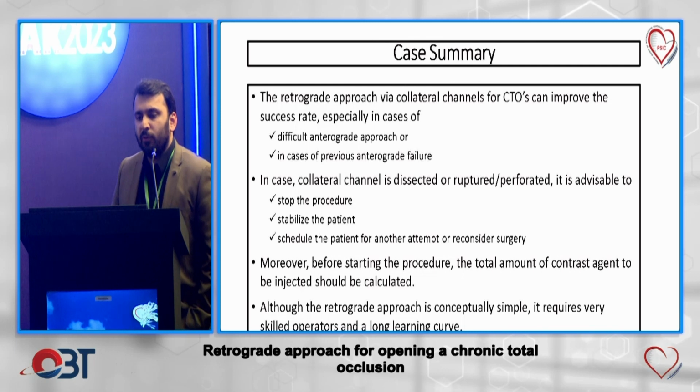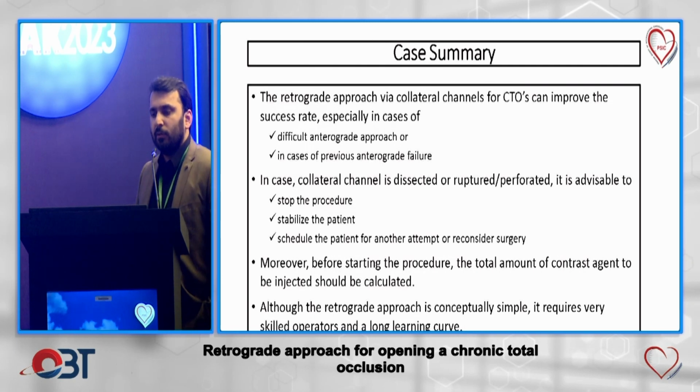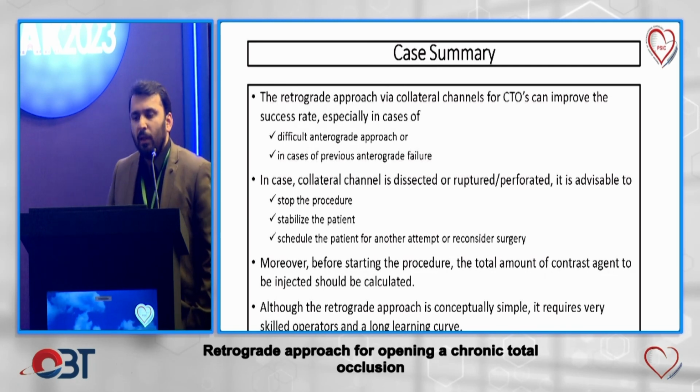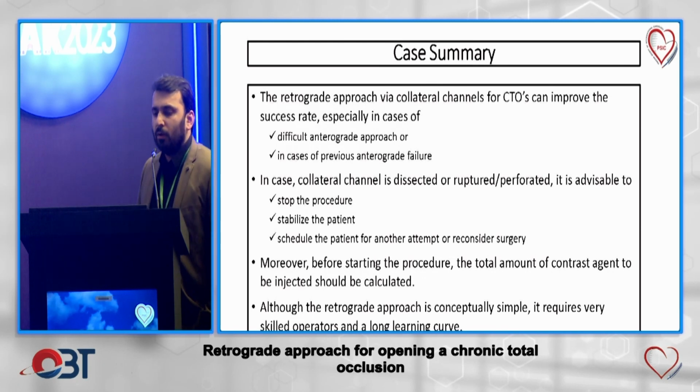Moreover, before starting the procedure, the total amount of contrast agent to be injected should be calculated. Although the retrograde approach is conceptually simple, it requires very skilled operators and a long learning curve.